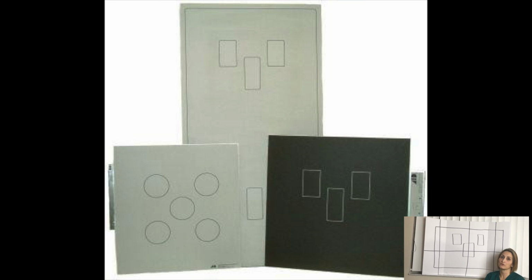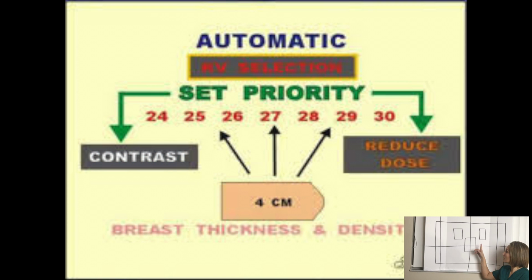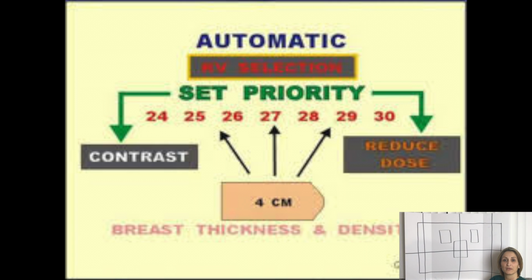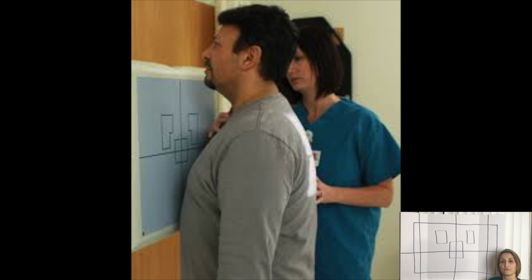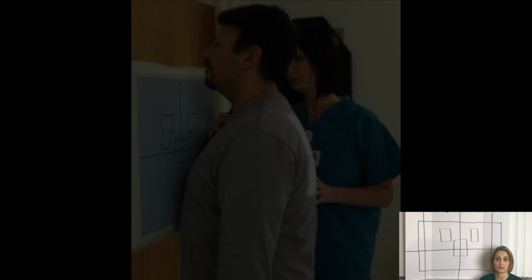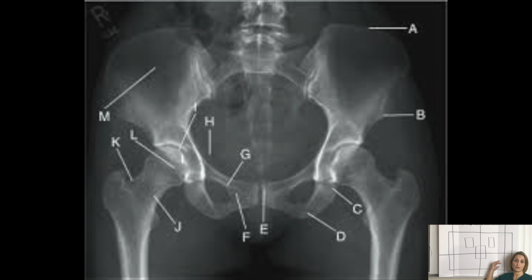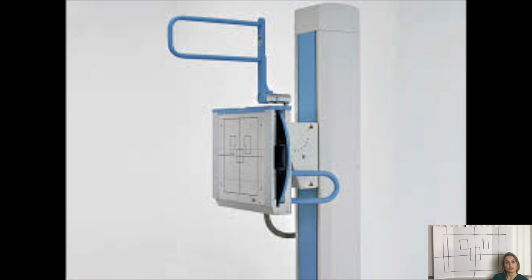All AEC systems work under the same principle: transmitting radiation through the patient and converting it into an electrical signal, ending the exposure time. The difference in AEC devices is the type of system used to convert radiation into electricity. There are two types: the phototimers, which are the first generation of AEC devices used in radiology and use photomultiplier tubes, which are not used today, and systems that use ionization chambers.